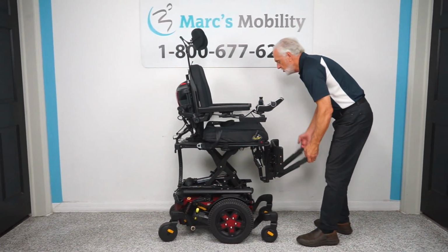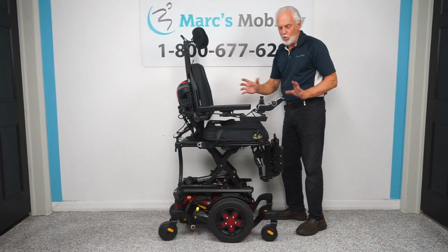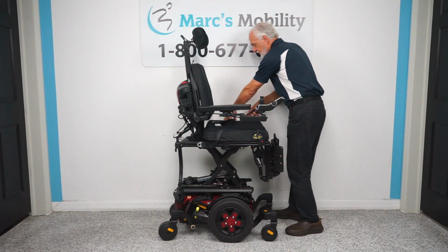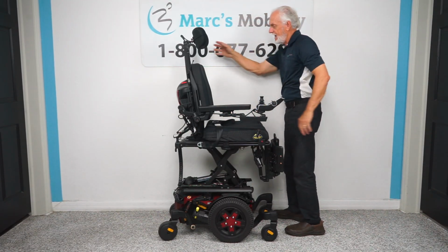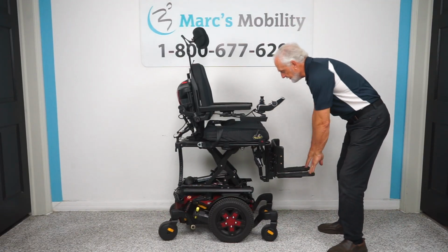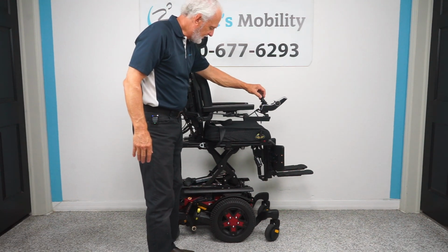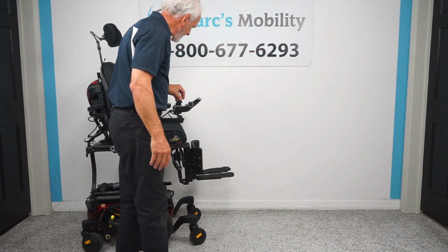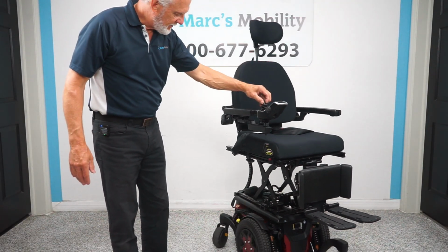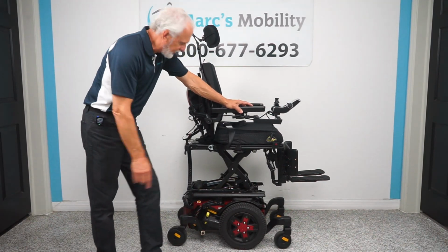If you're in the kitchen with this chair, when you come to your sink, you would come in this way to your sink. So if your sink is here, you would raise the arm. You want to work away from your joystick in case there's water. No water is going to hit on this side. So you do your dishes here. You can grab stuff from the first, second, third cabinet, depending on how high you are. That's just a suggestion, okay? Just to give you an idea, if you're in the kitchen, you work this way to your sink. When you back away, you back up this way, away from the wall, and then you take off again without hitting your sink or your countertops, okay? A lot of people have trouble understanding that concept, but this is the easiest way to save your boards, okay?